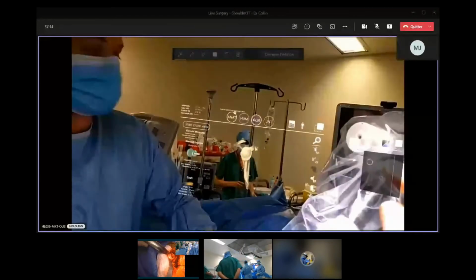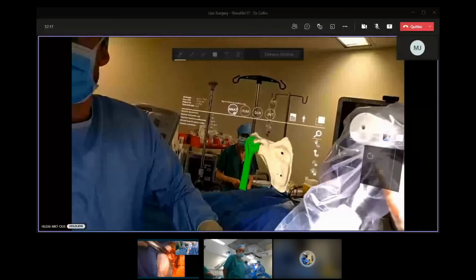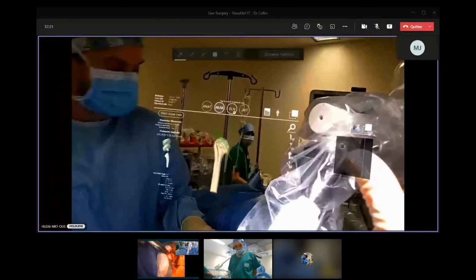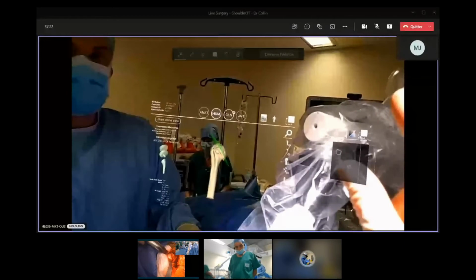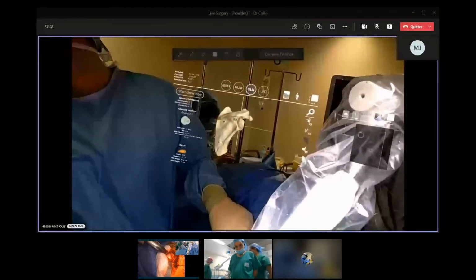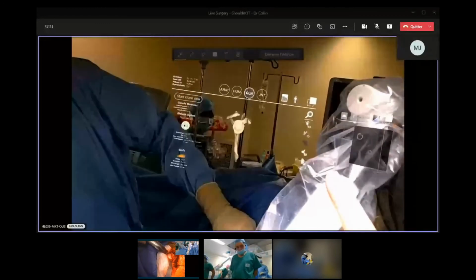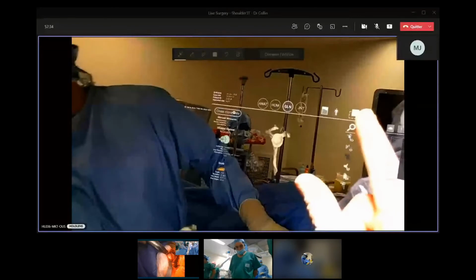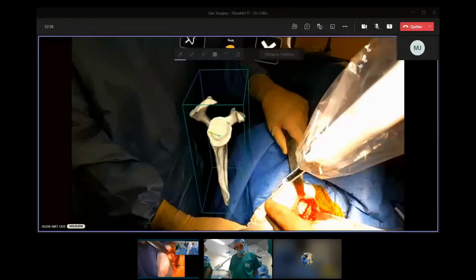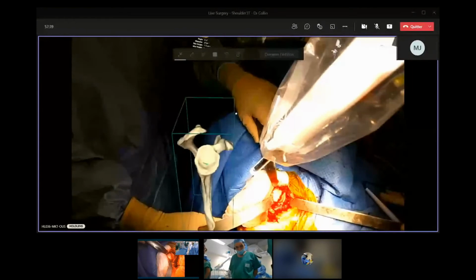I just remind you, we were in anatomic. Now we've done the humerus side. It's done. Now we're going on the glenoid side. This is what I've prepared, my entry point. You see that I should be a bit inferior, relatively at the middle. So I can start the clone view. And my clone view is here. And I can take it like this.